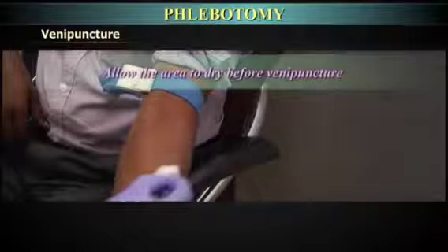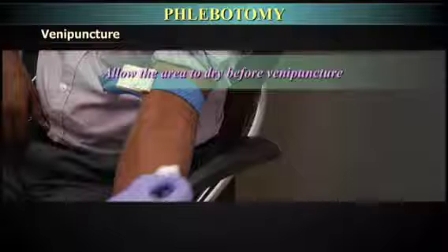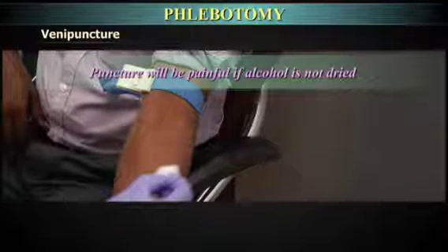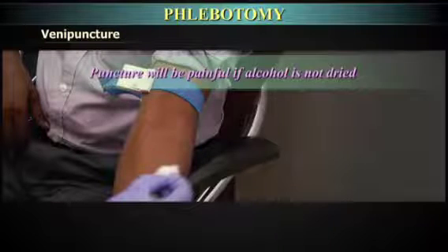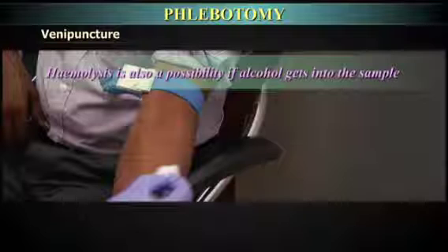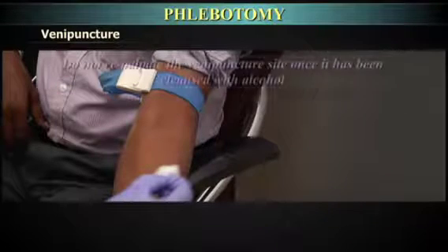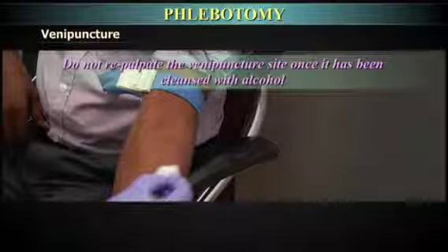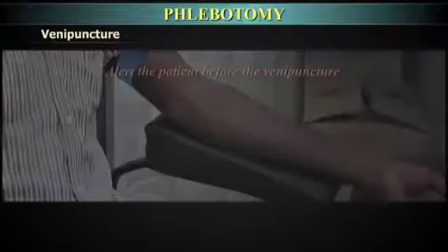Allow the area to dry before venipuncture. The puncture will be painful if the alcohol has not dried. Hemolysis is also a possibility if alcohol gets into the sample. Do not repalpate the venipuncture site once it has been cleansed with alcohol.